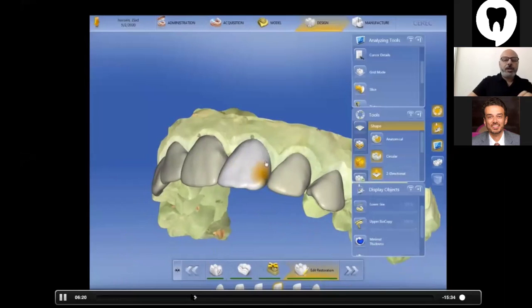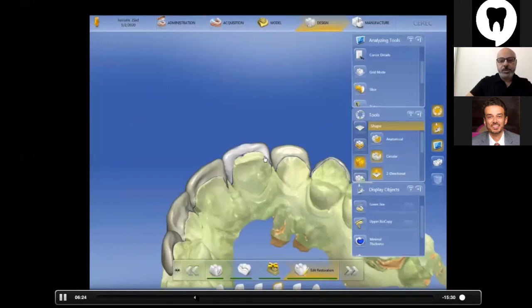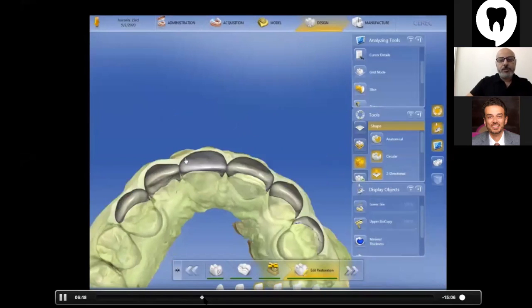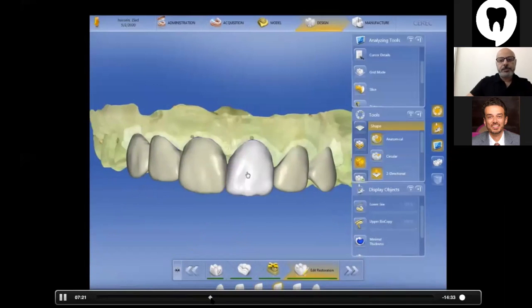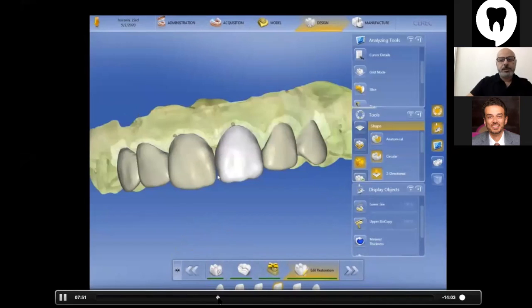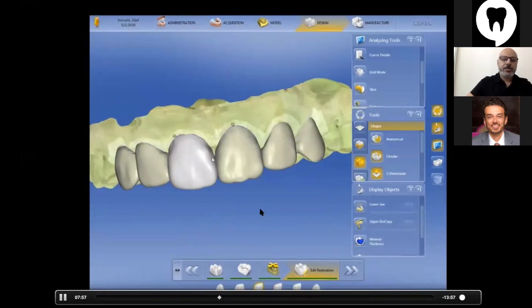If you want to increase or reduce any part of the teeth, it's the best tool whatsoever. Okay, I'm gonna go through the video. This is how we adjust them, and the incisal embrasure. And you can see here they're more alike.